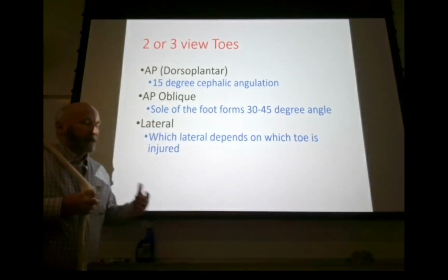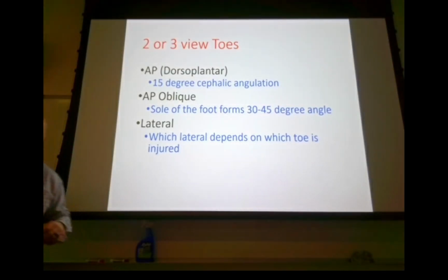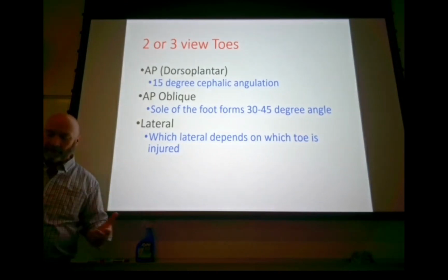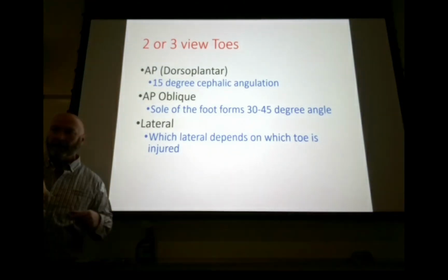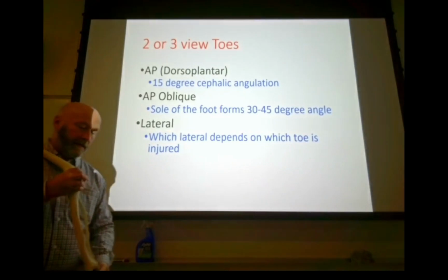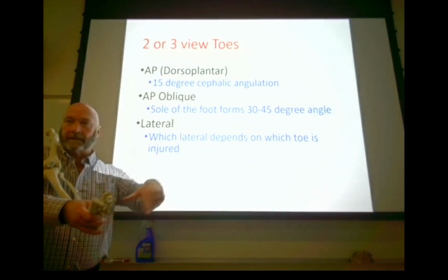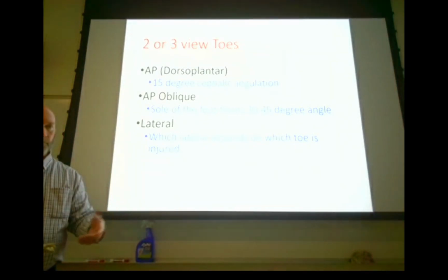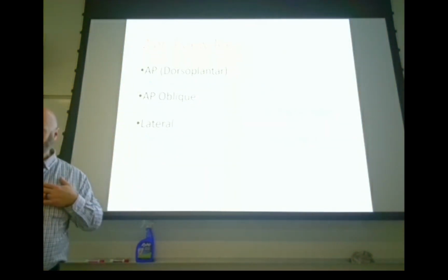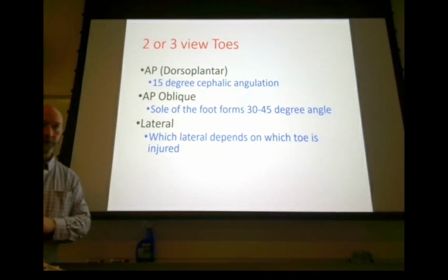Okay? So the other thing of note for toes that is different from fingers is everywhere that I've ever worked, we never did a single toe. We did all toes. And that's primarily because it's a little bit more difficult to pinpoint exactly where the pain is in the toes, right? You kick something, let's say just with the side of your foot, you bump into something pretty hard and the entire side of your foot hurts, right? So you can't say it hurts right there. So as a result, for the most part, when you do toes, and this is my personal experience, every hospital I've ever worked in, we did all toes rather than individual toes.